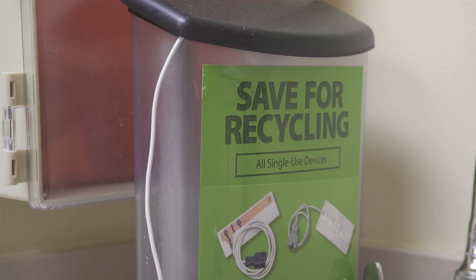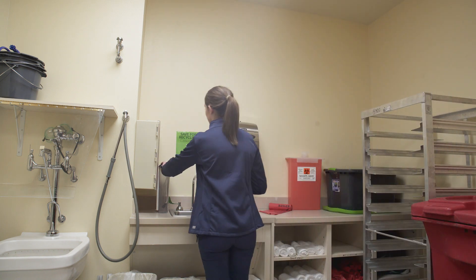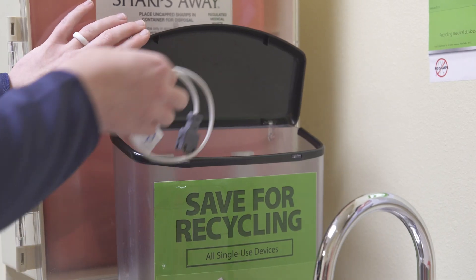Let's use this pulse ox probe as an example. After you save the device and put it in the reprocessing bin, our reprocessing company picks it up and sends it to their plant in Minnesota. After it arrives there, the device is taken apart and stripped down to its smallest components. Those components are cleaned, sterilized, and then the product is put back together with any porous or non-cleanable parts completely replaced.